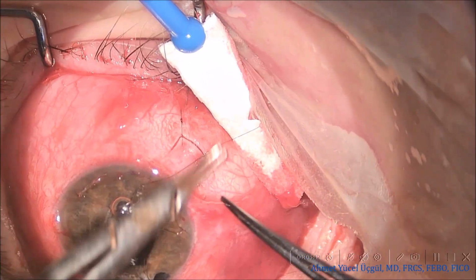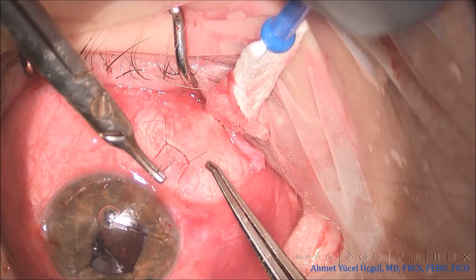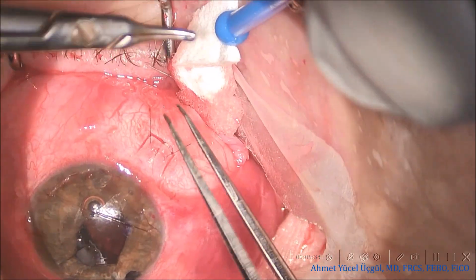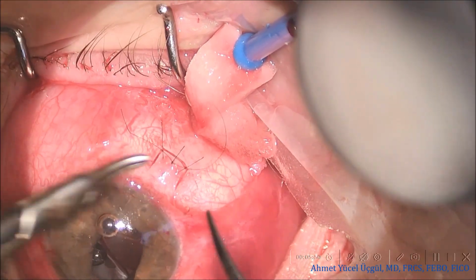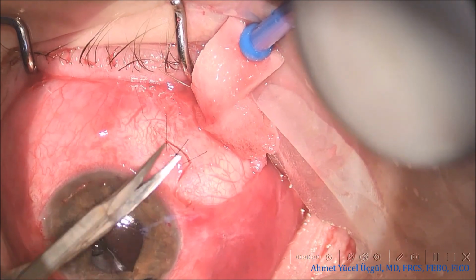However, special care must be taken while priming the tube in order to protect that valve. I prefer to prime the tube gently, avoiding excessive pressure, and if possible I use a 1 cc insulin syringe for more controlled irrigation. This is important because if the valve is damaged during priming, early postoperative hypotony becomes almost inevitable.